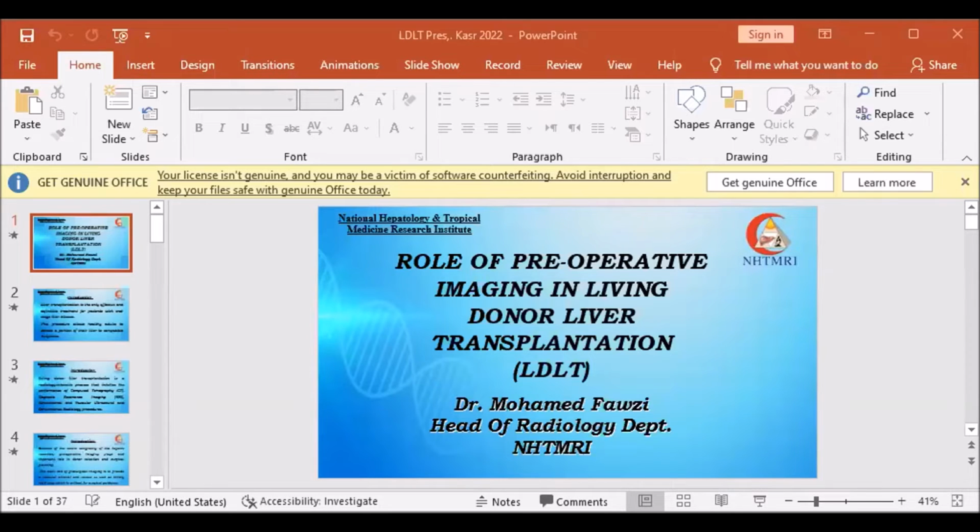And here also is that we have the right posterior from the main portal. And here we see the type 5, in which we have one single portal vein draining the whole liver. And this is, to my mind, an absolute contraindication for transplant. But maybe the trifurcation, now they have solutions for that. Maybe on the back table, they do anastomosis for the portal vein trifurcation. But it's a school in liver transplant.